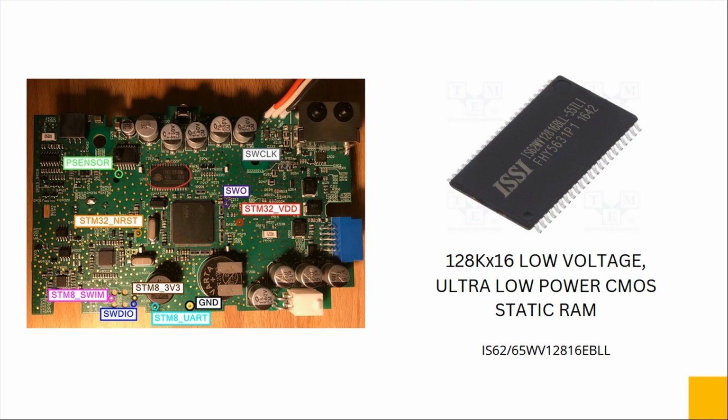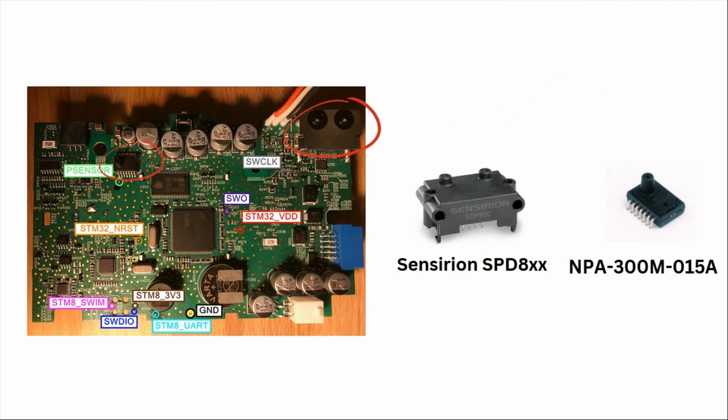There are two pressure sensors located on the main board, one being a surface mount one, which is the NPA-300M, and one being a through-hole component, the Sensirion SPD8. The NPA is only able to measure pressure, and it does that just by measuring it relative to atmospheric pressure. Typically, units of pressure are measured in centimeters of H2O, or centimeters of water. This can handle between 10 to 30 centimeters of water, which is typical for any CPAP treatment. The Sensirion pressure sensor is a differential pressure sensor, so it measures between those two holes, or those two points. It's also able to measure humidity, giving us data such as that.